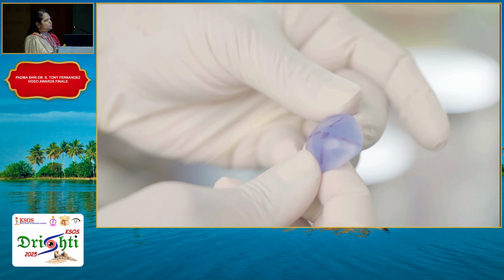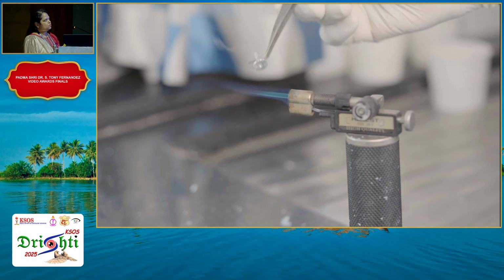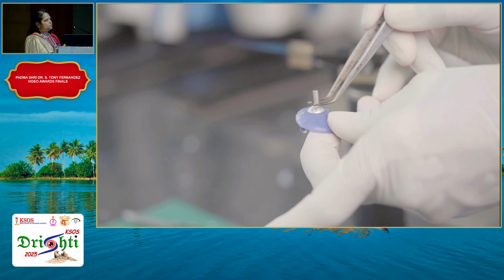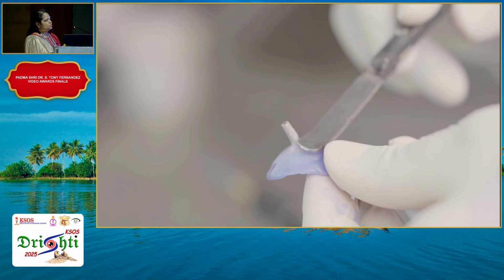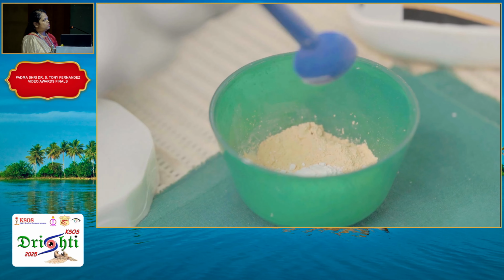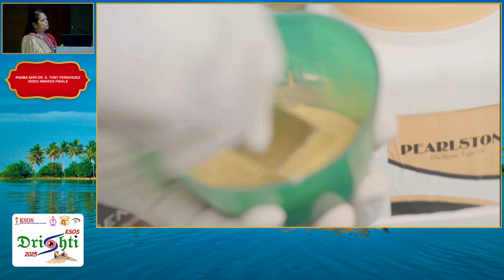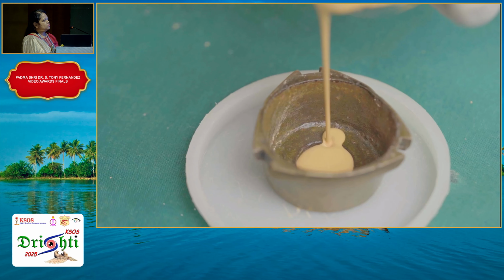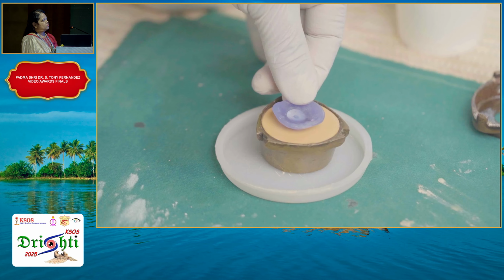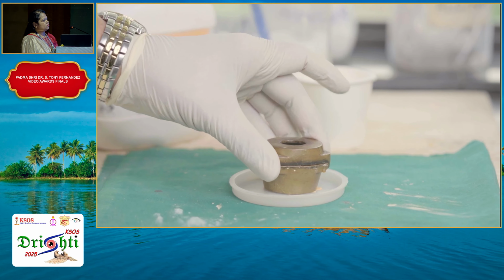Carving the wax. Once the wax mold is ready, an aluminum corneal button of the fellow eye size is taken and placed on the wax model. The wax is smoothened by carving with a scalpel blade and hot flame. Once the wax model is perfect, the plaster mold is made. Plaster of Paris and dye stone powder in a ratio of 3:1 along with water is made into a paste. This paste is filled in an eye flask up to the rim. Then the wax model with the corneal button is placed in the flask and allowed to set.